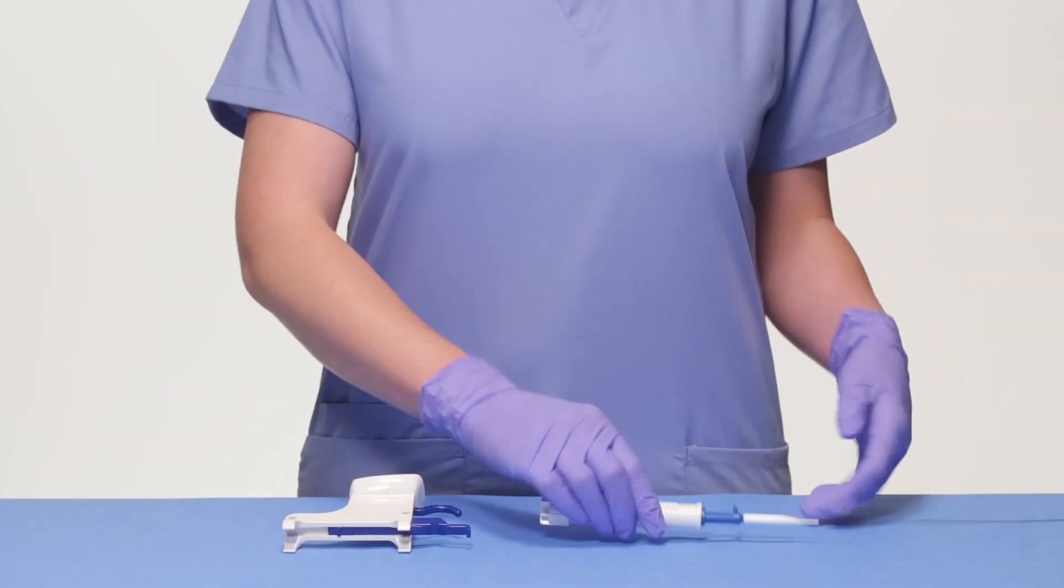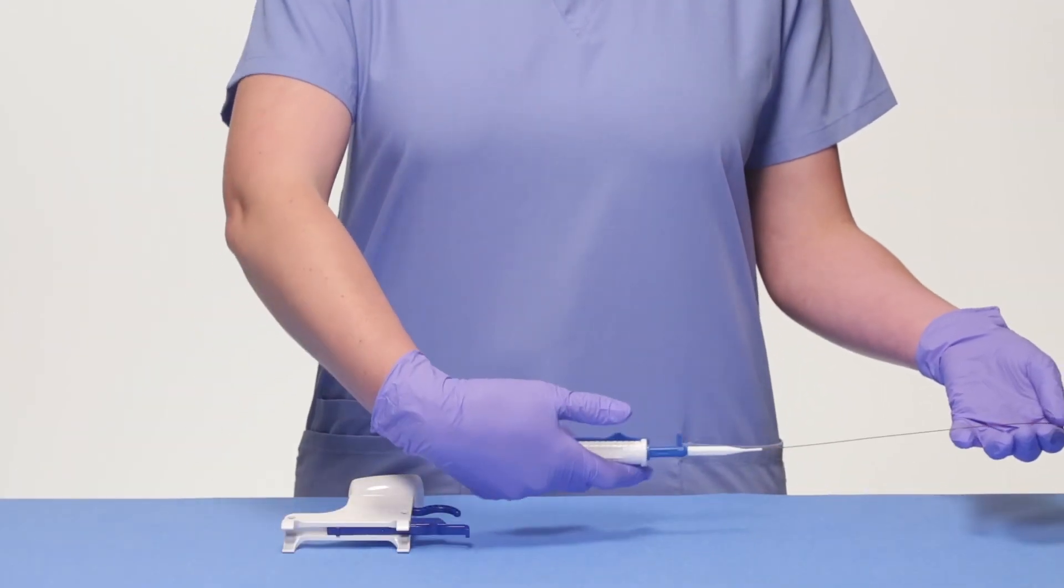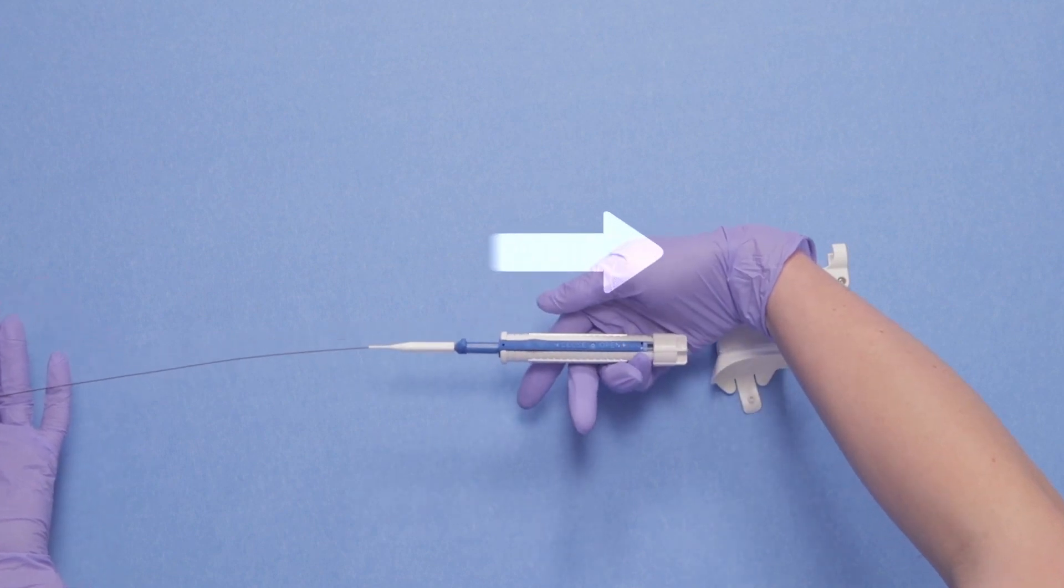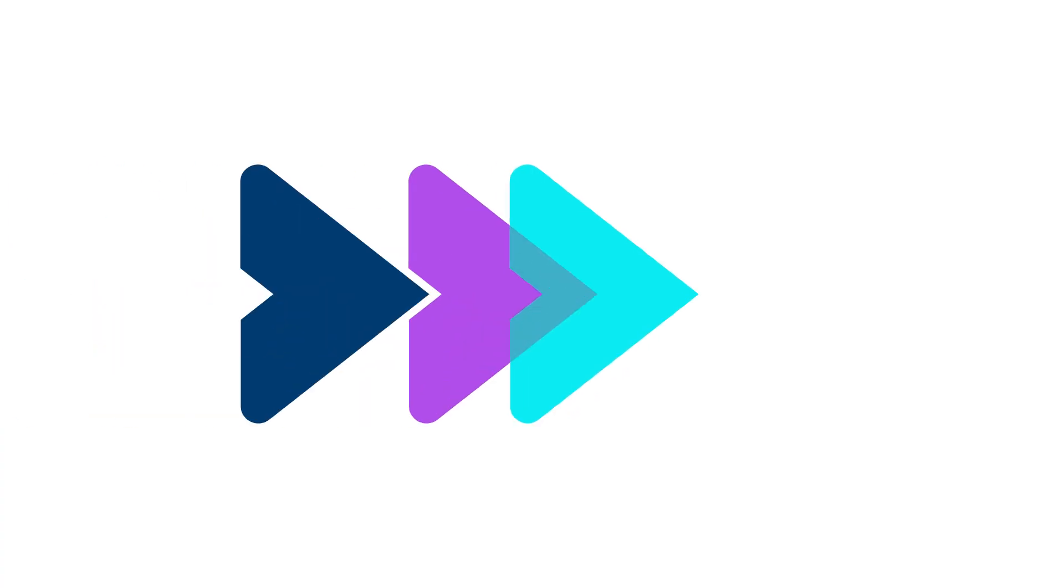The first step is to connect the LithoVue Empower device to a nitinol basket. To secure the retrieval device onto LithoVue Empower, the basket must be in the fully opened position by sliding the handle back completely.